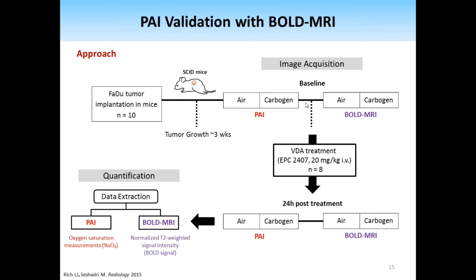In between photoacoustic imaging and BOLD, we let them recover for about 15 minutes, and then we re-anesthetized the animals, and again, we imaged for about 4 minutes during air breathing, and then 8 minutes during carbogen breathing.